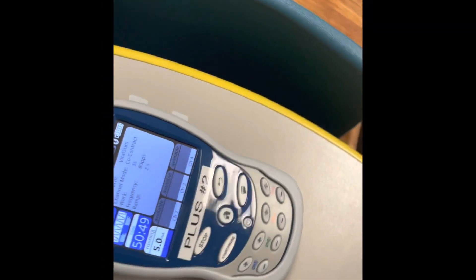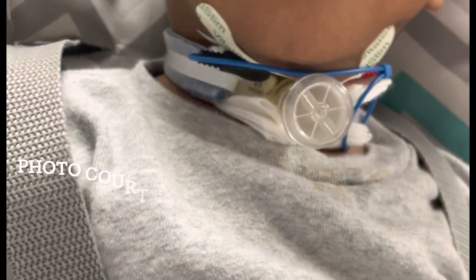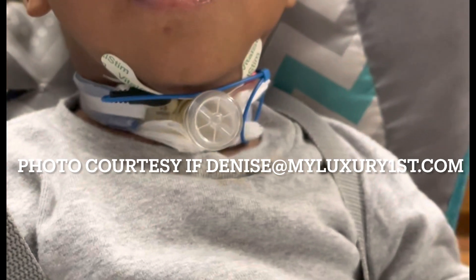I will be showing you a little bit of what happened during the session. The NMES device has dials that go from 1 to 25, and he got up to about 8 today. This is my son's trach, and we're trying to treat his throat for dysphagia. In the next two months, we'll be using the VitalStim for his swallow therapy.